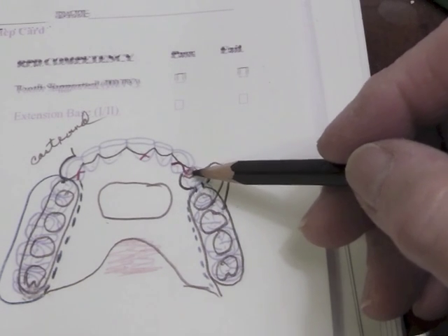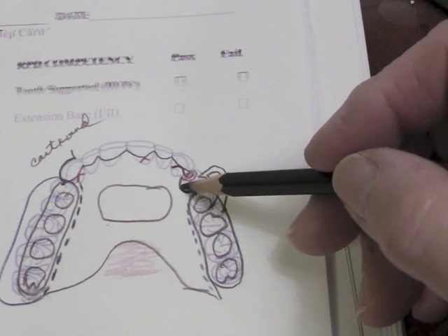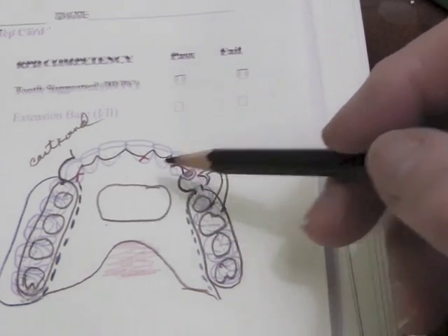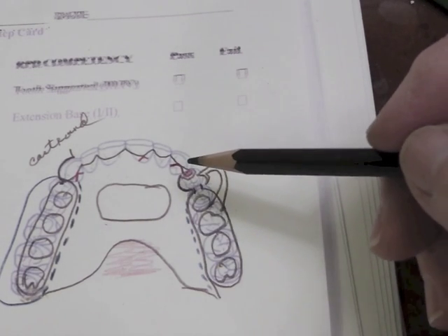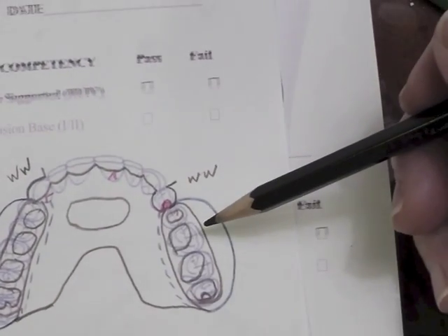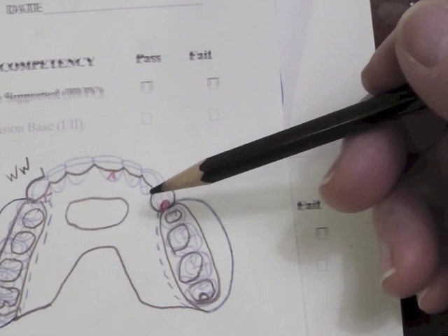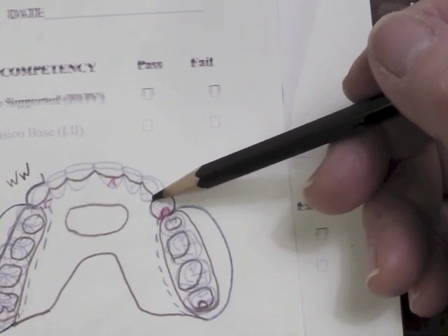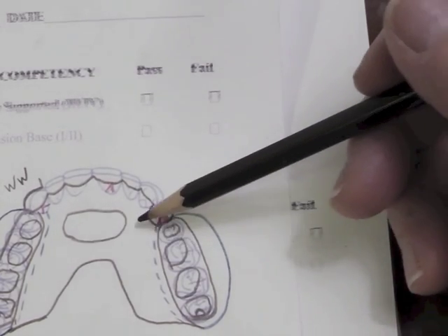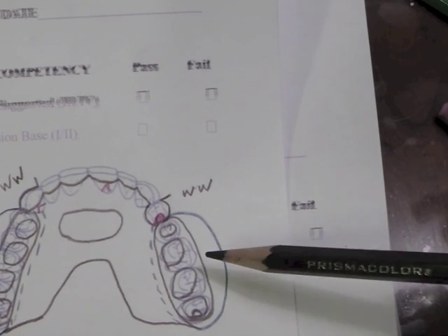That design calls for an embrasure rest, and instead of dipping down I plated it right at the survey line — because if I dipped down it would probably interfere with putting much of a hole in the palatal area. In another design I drew the wrought wire on the distal abutment, which calls for a distal rest, a wrought wire clasp to a 0.02 mesial facial undercut, and plating at the survey line on the lingual aspect. This one is nice in that it's symmetrical on both sides, doesn't dip down, and wouldn't trap food while eating — a simple design that would also be a good working design.